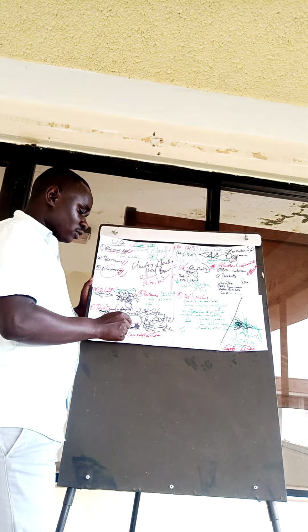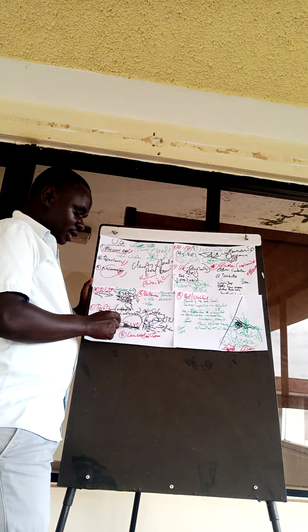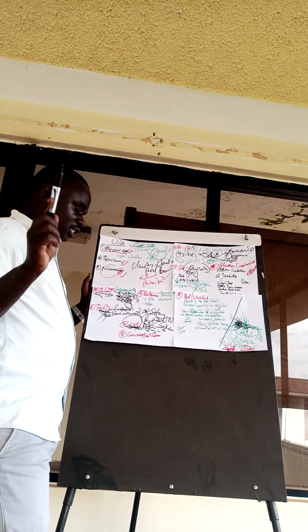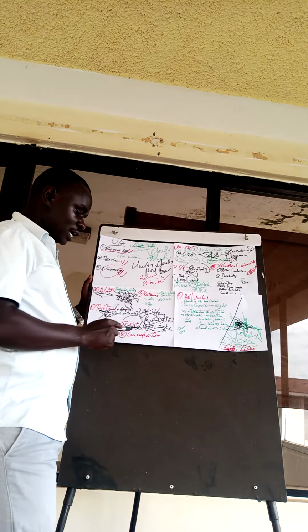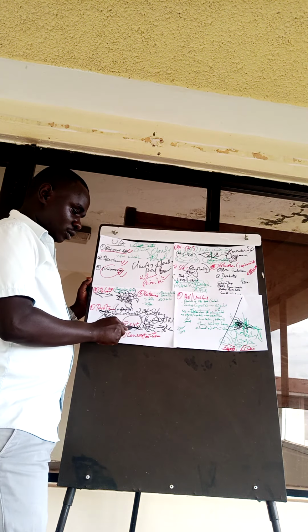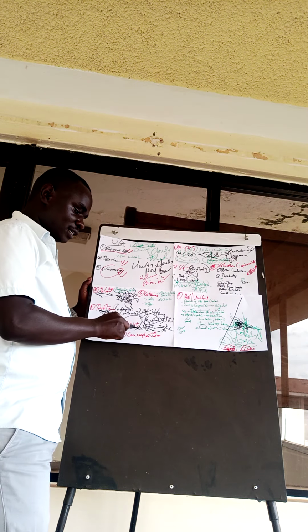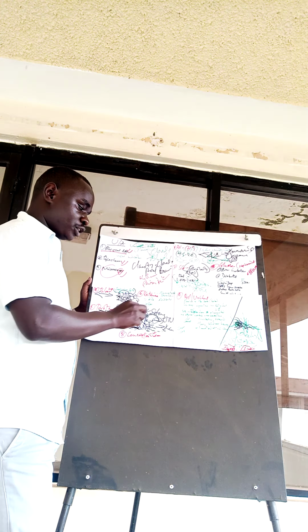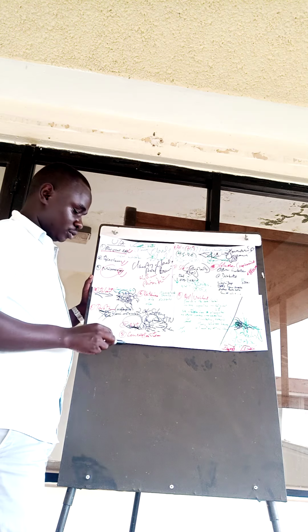But the presence of nitrite in urine indicates that there has to be a bacteria responsible for the conversion of nitrate into nitrite. So, it is a very important indication of bacterial infection which could result in UTI.